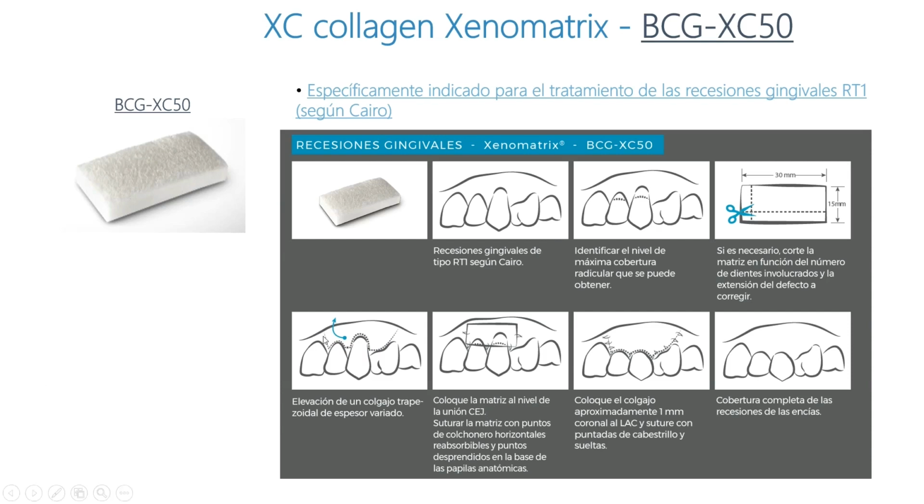Then the Xenomatrix, as we can see, is put in order to reach the planned height of the soft tissues. And then there is the suturing, and with the healing at the end, the complete coverage of the root of the teeth involved.